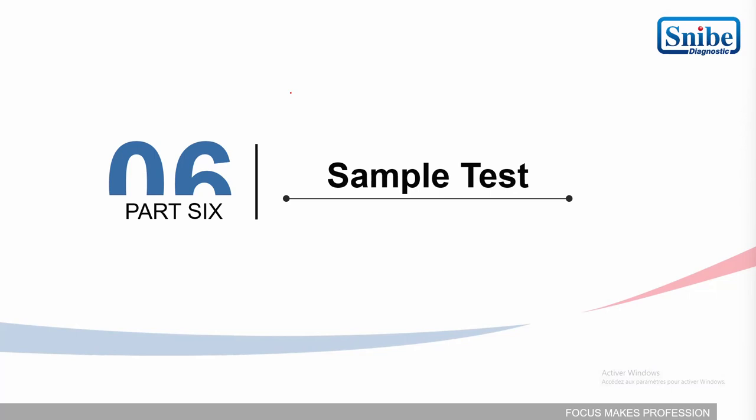Yeah, I think there are results for the comparison, but we cannot compare. In all CLIA, we cannot compare the results for samples or for QC because they are using different materials. So in the CLIA technique, different manufacturers, Abbott, Roche, Siemens, and Snibe, and so on, use different materials for the labeling and for the separation.